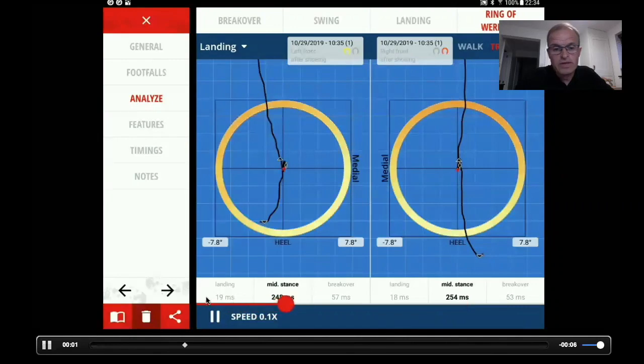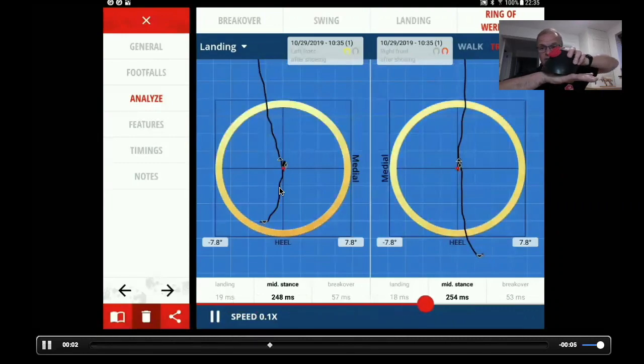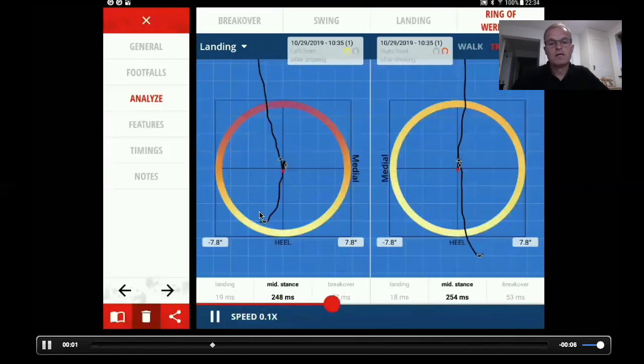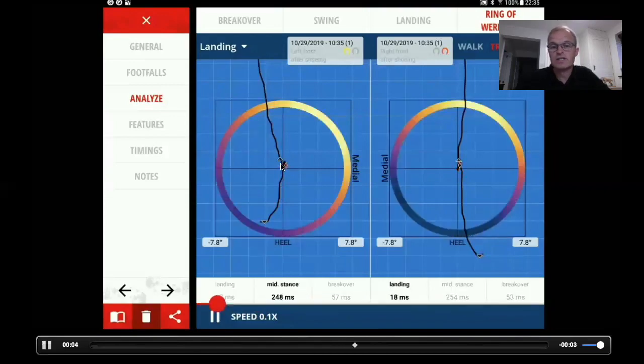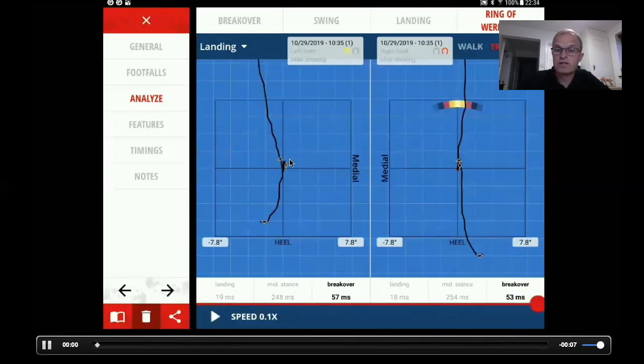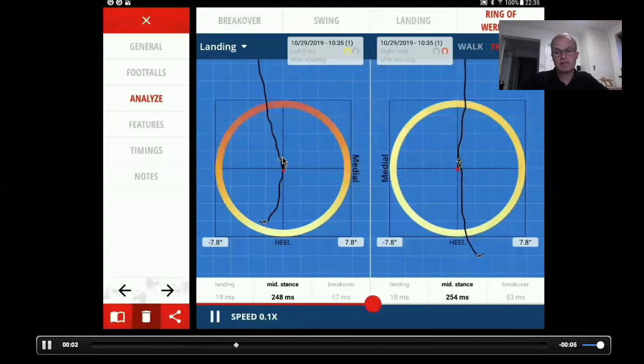So again, we've got all the numbers relevant here. What we want to see is a smooth transition, and what I'm starting to see with more and more measurements that I do, if there's a smooth transition into landing, into mid stance, and then breakover, very much like when we're walking, just the same. But if you've got big interruptions in mid stance, and the thing we've got to consider here is how amazing this device is when we're measuring on soft surfaces. We can start to understand the function of some of the shoes that we're going to apply and how they alter the horse's stability in mid stance, especially on soft ground.